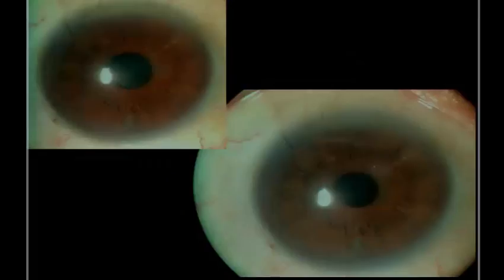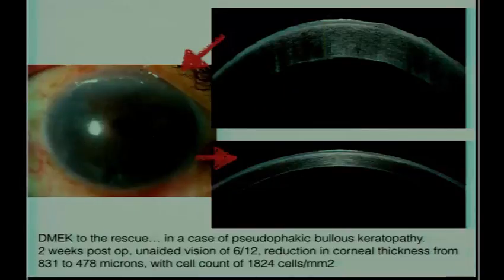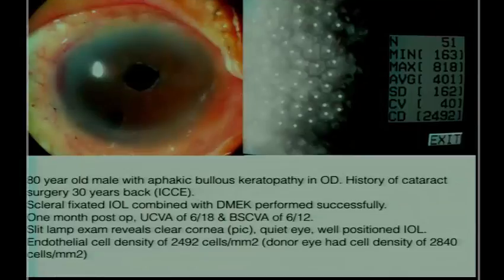That's how it looks post-operatively. The visual recovery is rapid. If you see this, this is somewhere on the fourth post-operative day. You can look at the cornea, it looks clear, and the dramatic change that you see is in the anterior segment OCT. You see that the corneal thickness really goes down very rapidly. Even by the third post-operative day, you can see that the cornea almost looks like a normal thickness and normal contour.